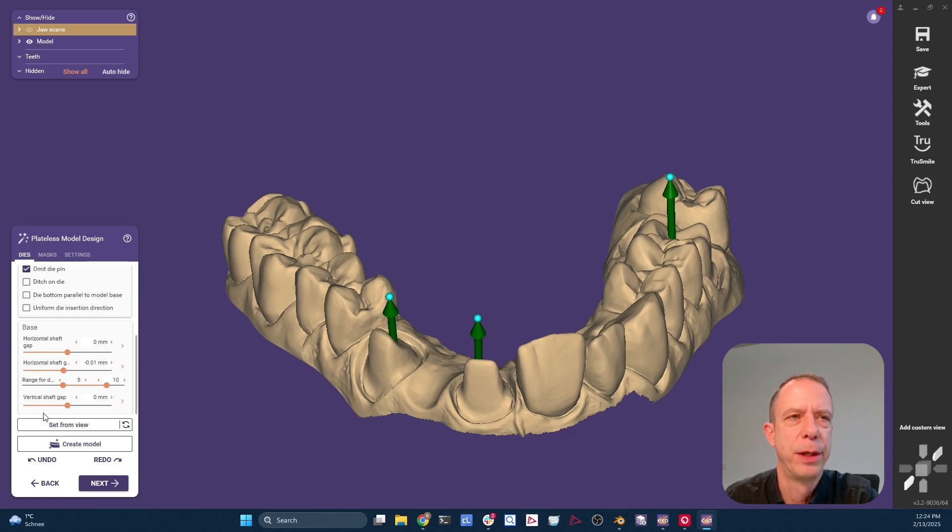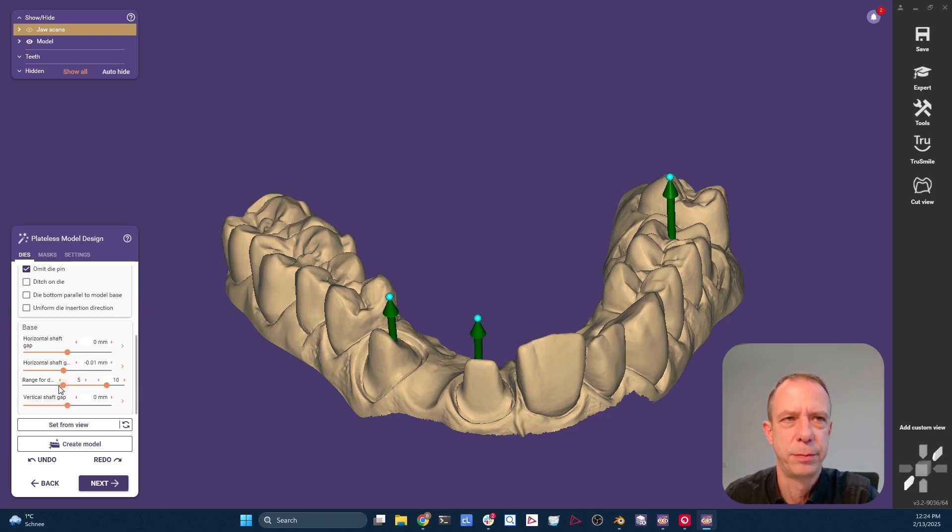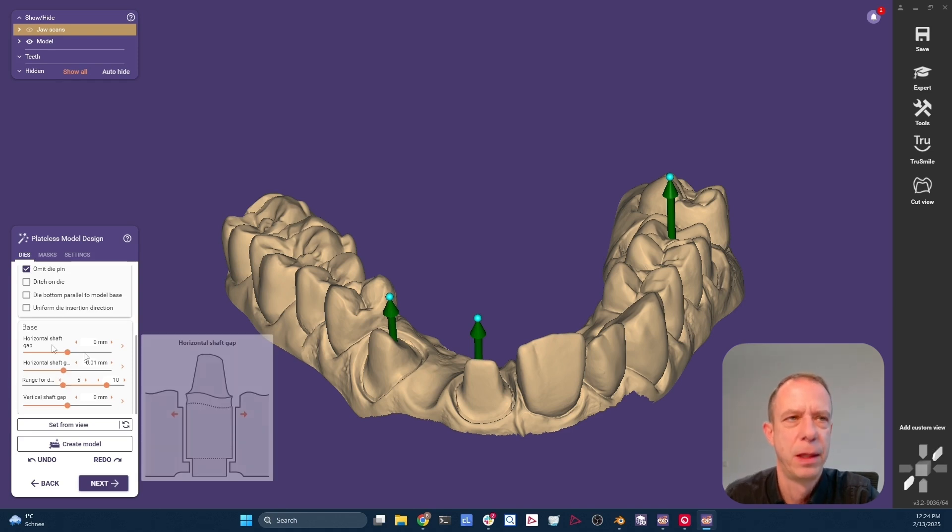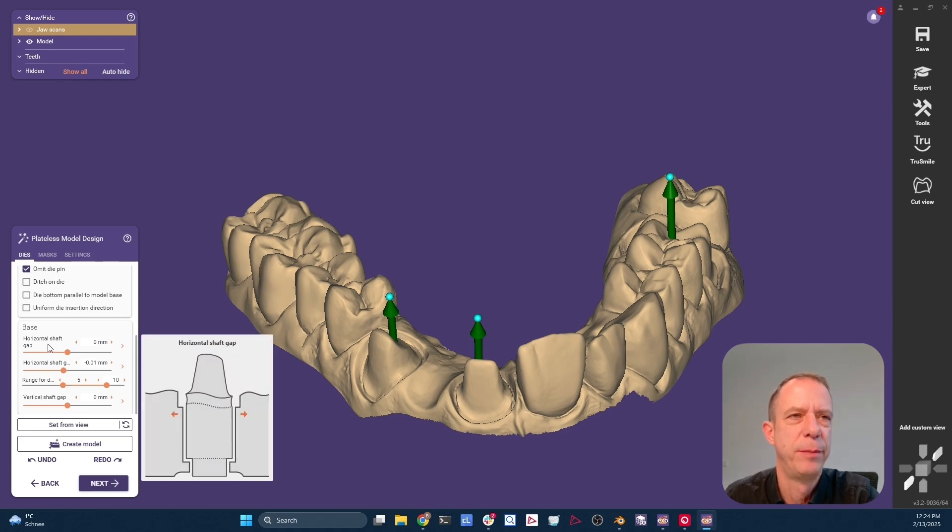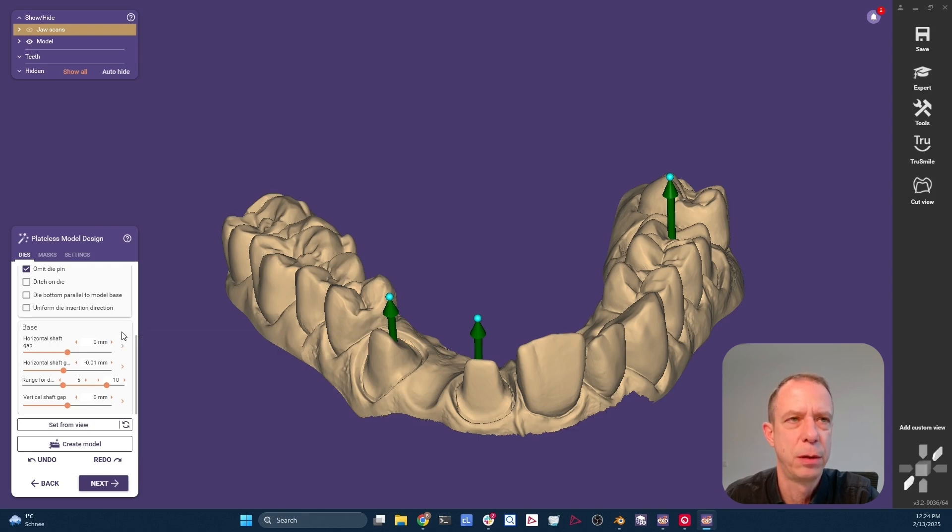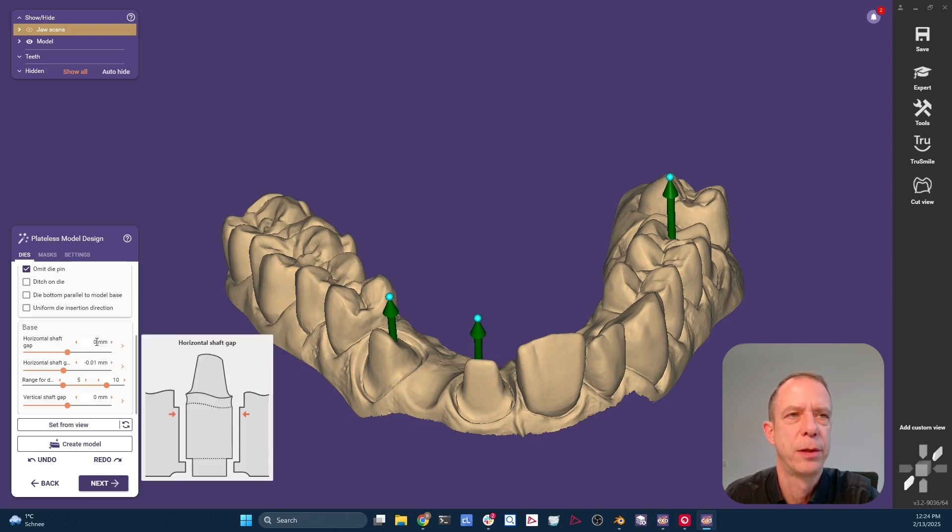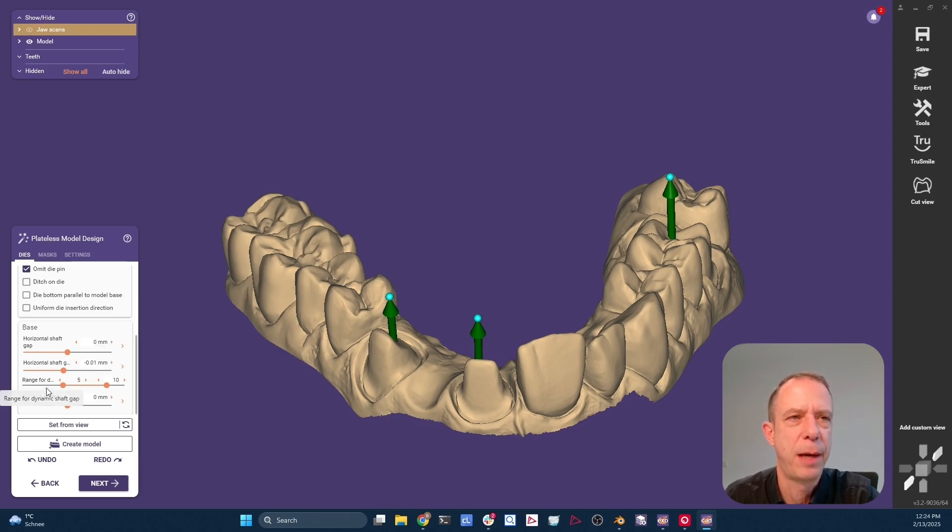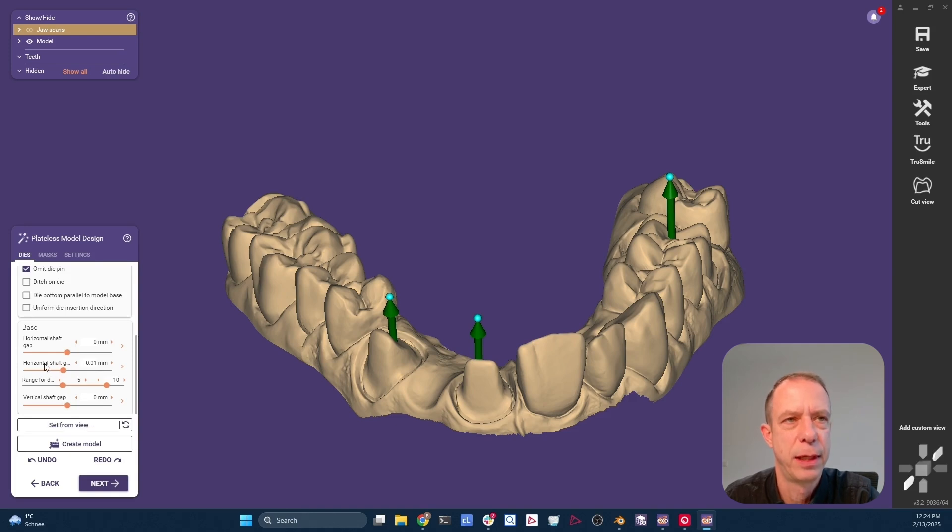Now in this section here, in this tab, this is the most important part here that controls the friction. We have one value that might be pretty familiar to you, which is the horizontal shaft gap. This one with precision model should be set to zero. And then we have a couple of new sliders and values in ExoCAD.